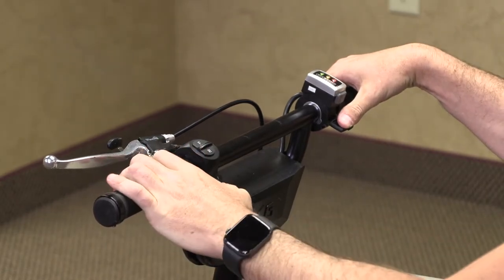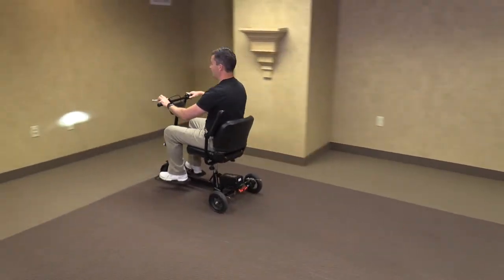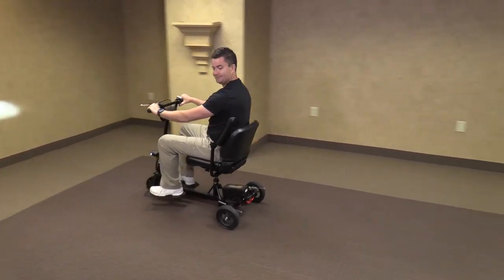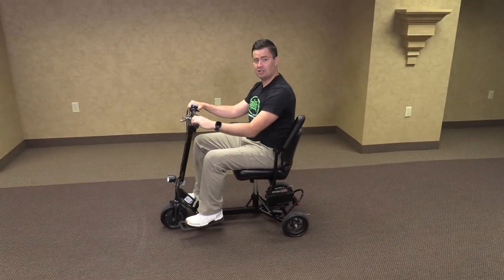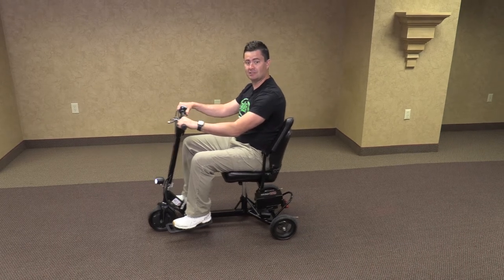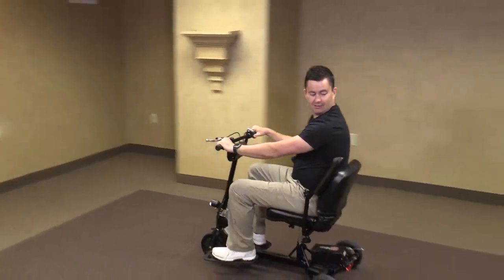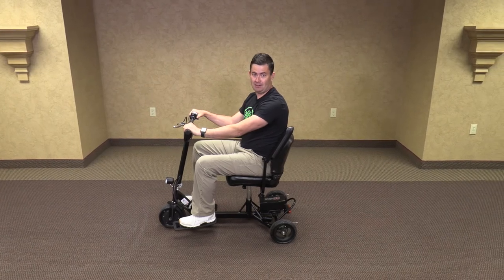Now it is disengaged. Set it forward on 1 and we can go forward. And reverse. When changing speed settings, you just move it to whatever setting you want — 1, 2, or 3 — and depress the thumb accelerator. And when reversing, always be aware of your surroundings behind you.